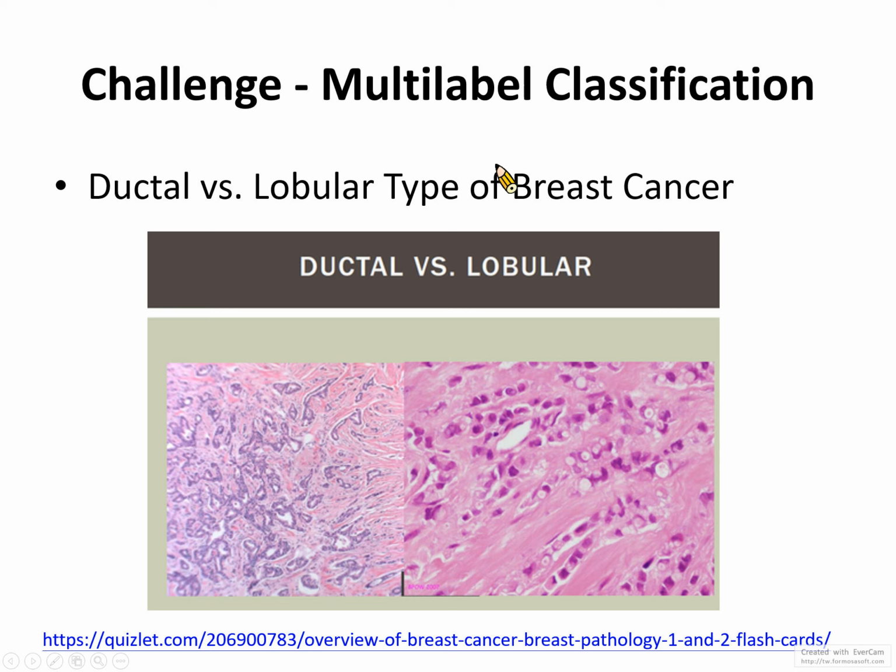So I hope that you can practice on these data sets and learn how to do the case presentation too. You are also welcome to modify the codes I provide to you, and also study the codes to learn how to do deep learning on medical images. Okay, so enjoy the course, and I hope you can do the case presentation too without any hurdle.